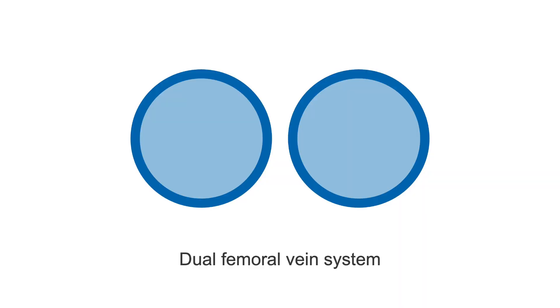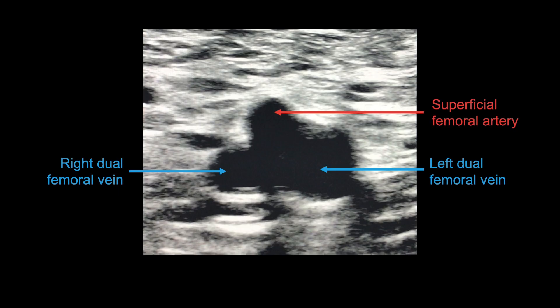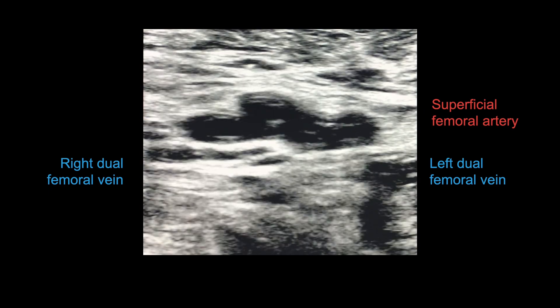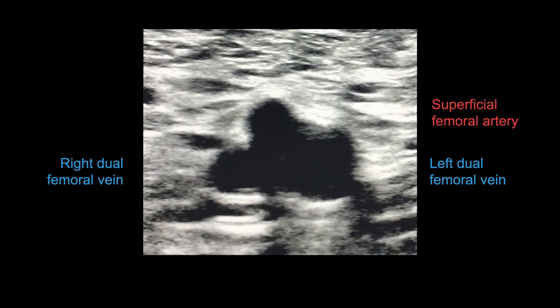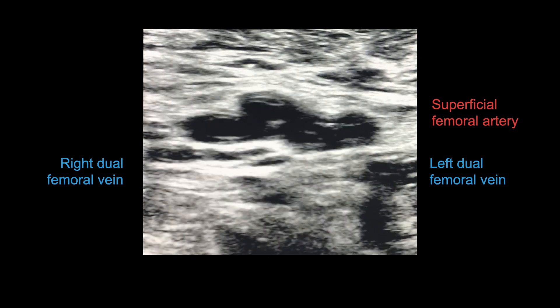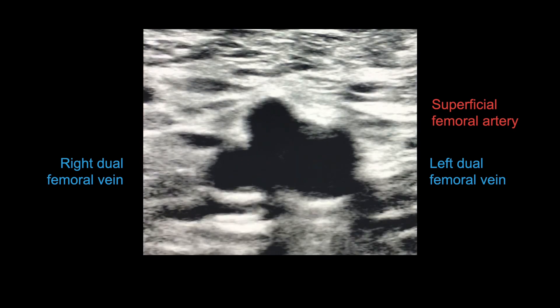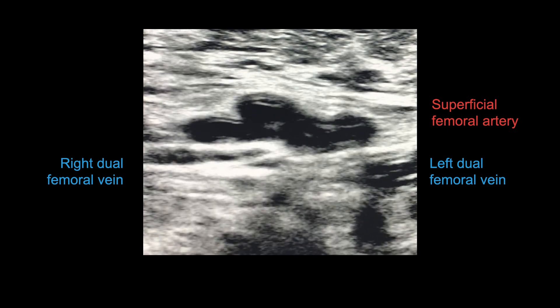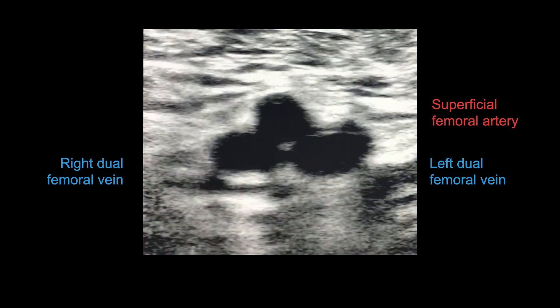There may be a dual femoral vein system. If you see this, then you must test both femoral veins to check if they both coapt. This video shows a dual femoral vein system where only the right vein is fully compressible. You can see the left vein, on the right of the screen, is less compressible than the right one, as it contains a blood clot. In this example, you can even see that the superficial femoral artery at the top partially compressed because so much pressure was applied.